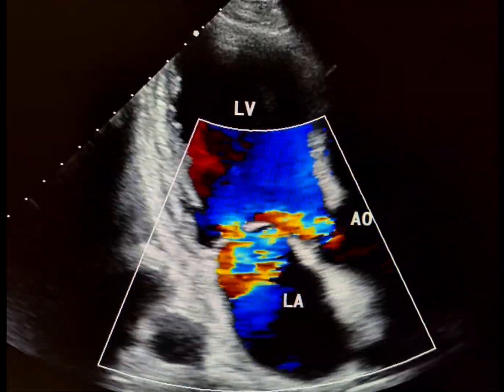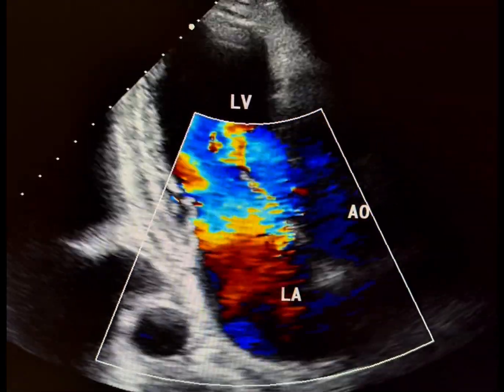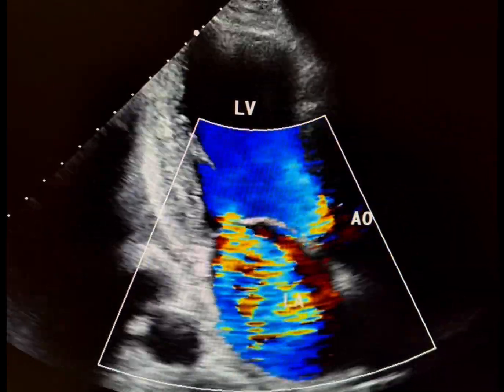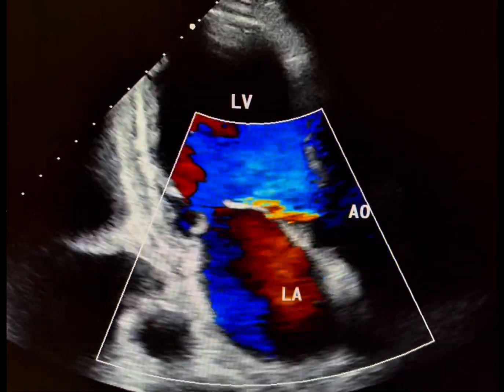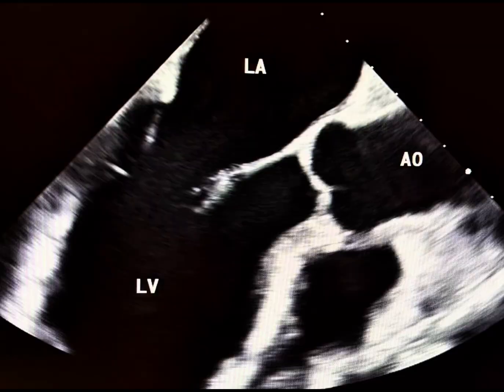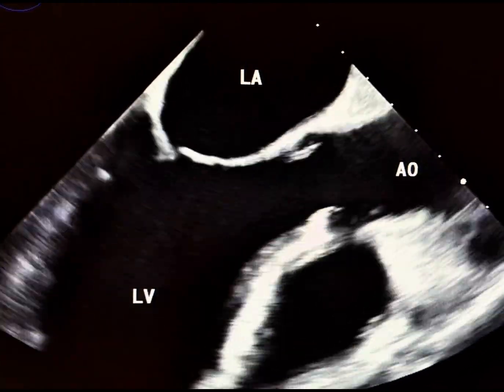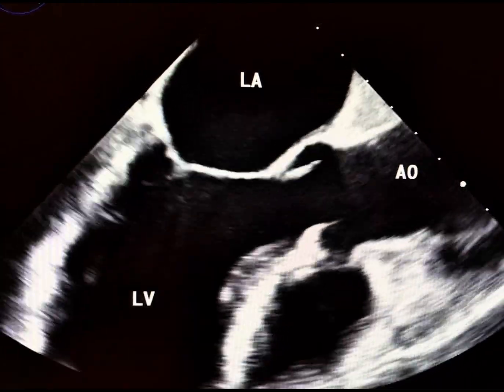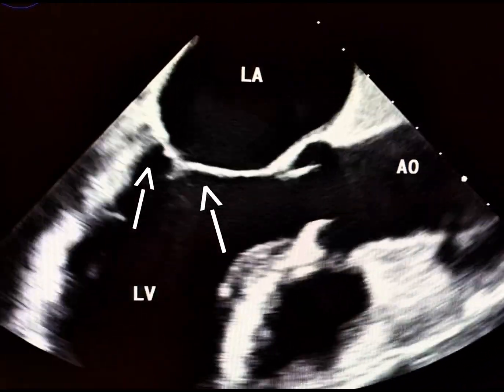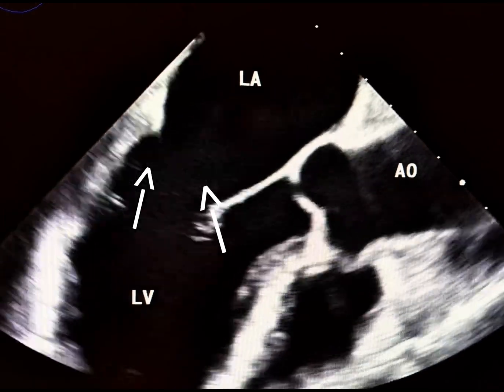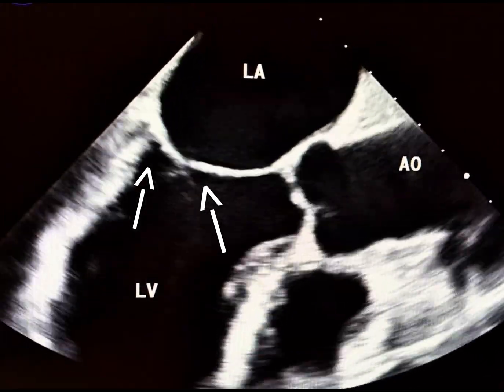That's why it's crucial to evaluate the mitral regurgitation in the context of LV size and function. This tethering of the mitral valve leaflets causes them to appear tent-like, which is a hallmark feature of functional MR.